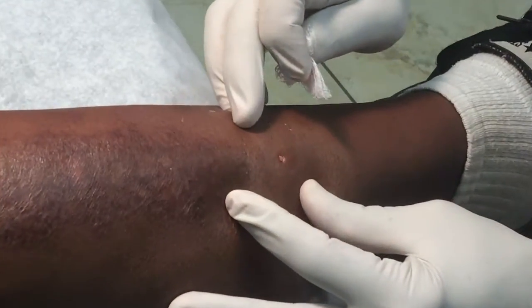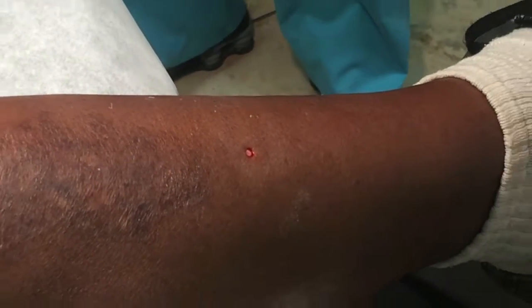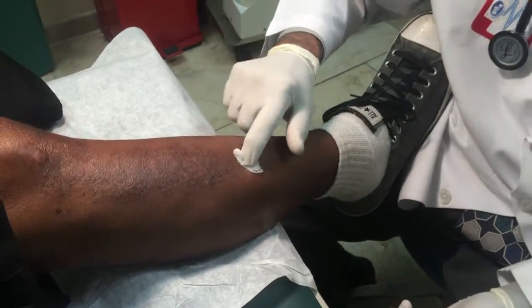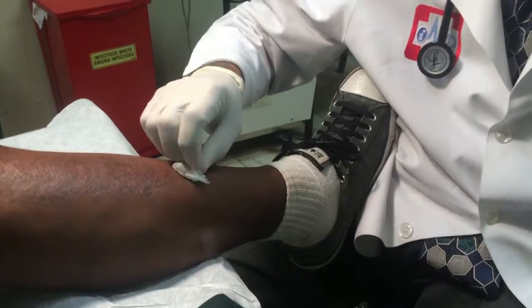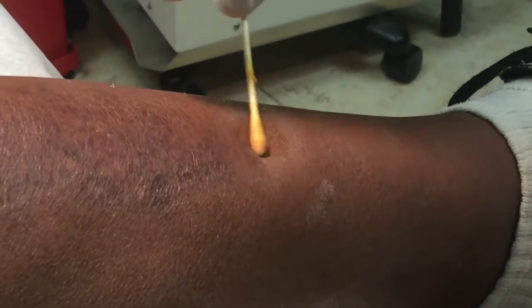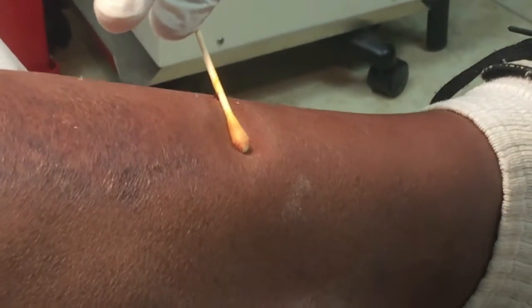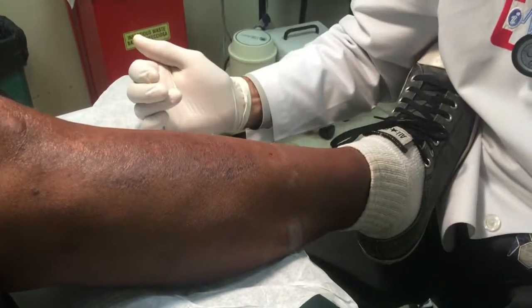This is the remaining part of the lesion. You can see there is very little bleeding — just a small slight oozing. You can use a Q-tip and ferric sulfate. Ferric sulfate is an astringent which will precipitate the superficial protein and will stop any small oozing. With a sliding movement, just go back and forth, pause a little in the center, then wipe off the extra ferric sulfate and make sure it's dry and there is no bleeding.